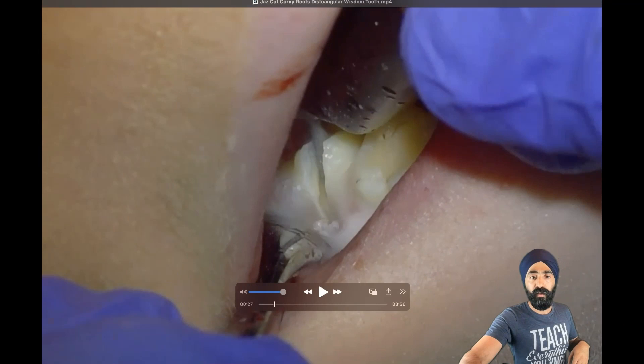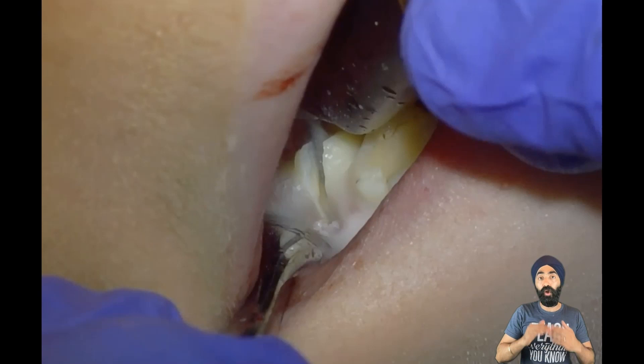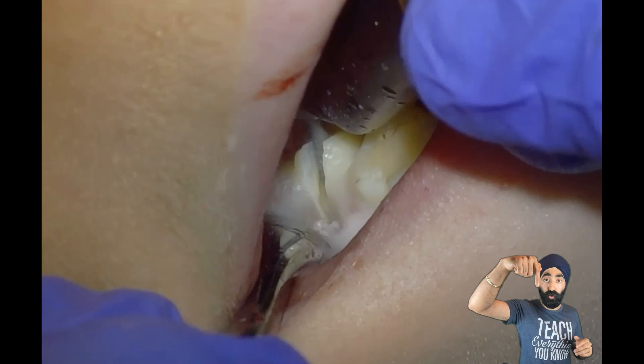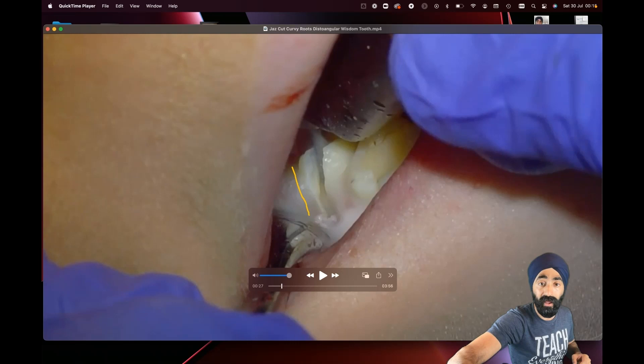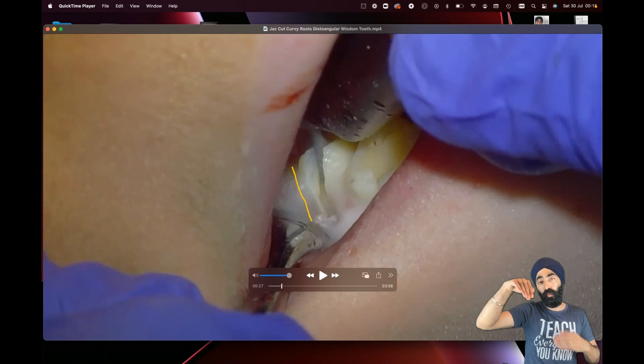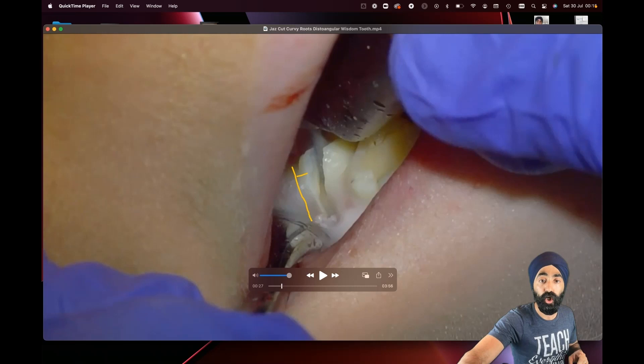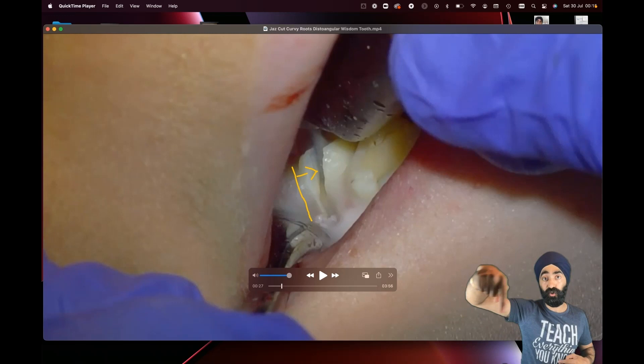The furcation is roughly there. What we're trying to do with this section is get to the furcation of the tooth so we can split both the mesial and distal roots. If you try to put your burr where the buccal groove is — where logic tells you — then your section usually ends up being too distal. The top tip from Dr. Neki Jamal: always do your section two millimeters mesially from where you think the furcation is. That way you're more likely to hit it, and hitting that furcation is most of the secret of removing these teeth.